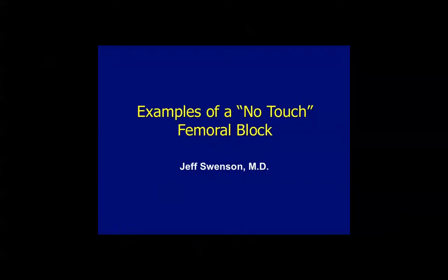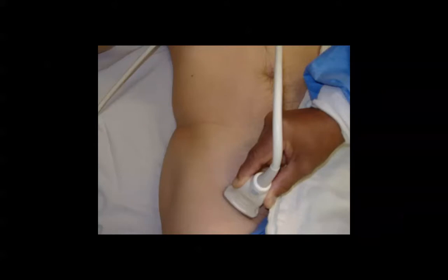Hello, we're back with some examples of a no-touch femoral nerve block. I want to review just a few things before we look at some examples.